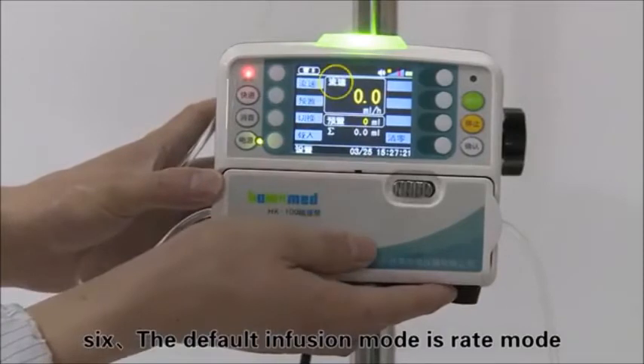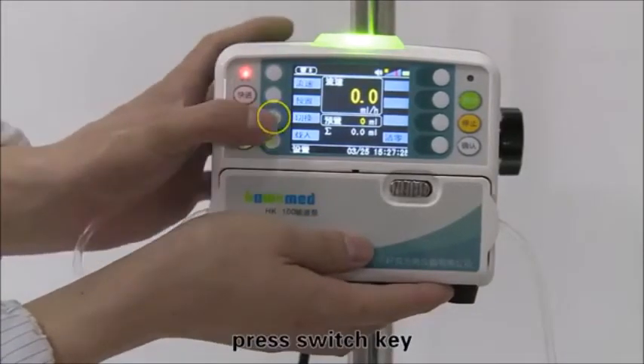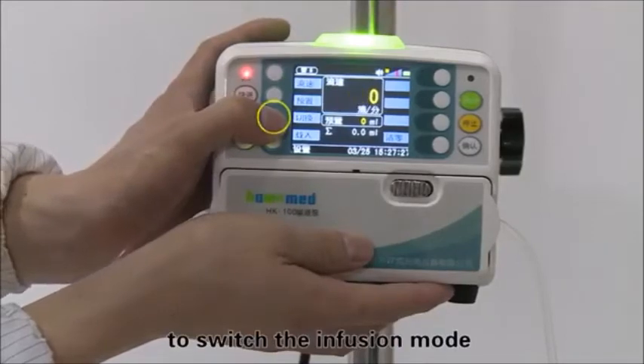The default infusion mode is rate mode. If drip mode is needed, press the switch key to change the infusion mode.